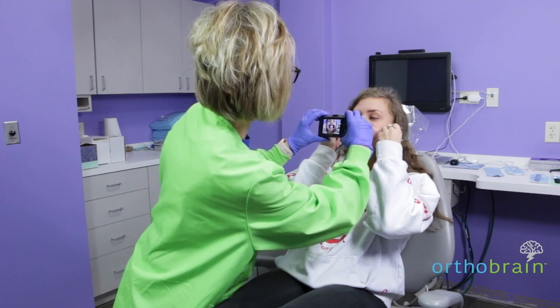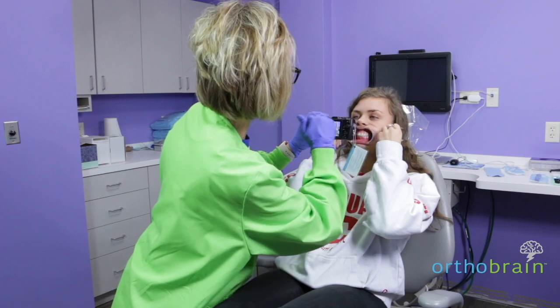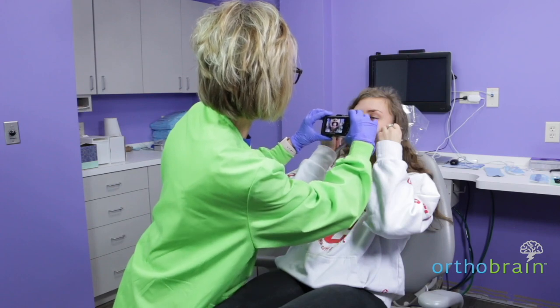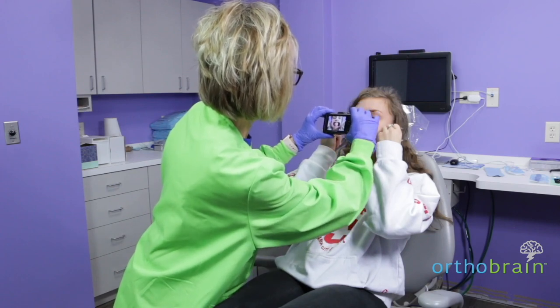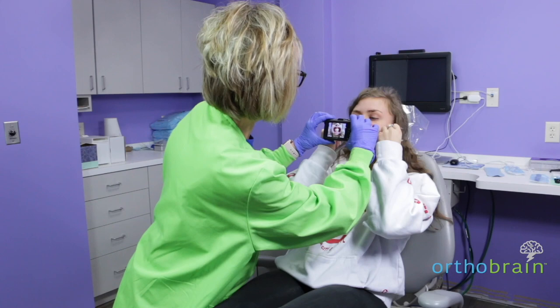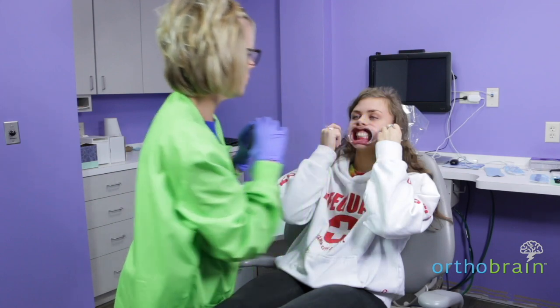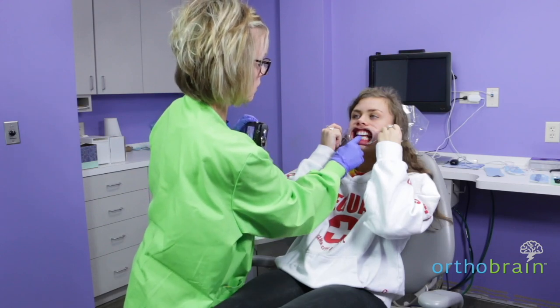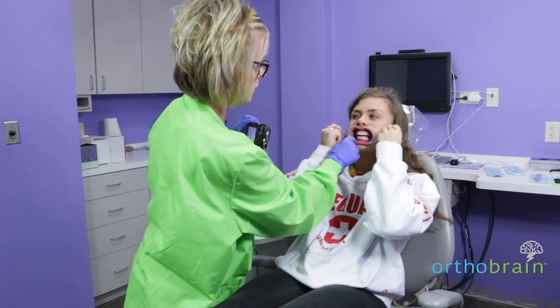You want the occlusal plane to be straight — not tilted up or down. You want to be straight on. Open just a little bit. We want to see the occlusal edges of the teeth and the gum tissue.